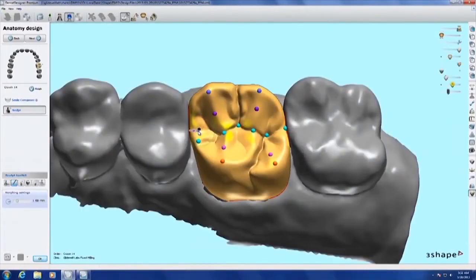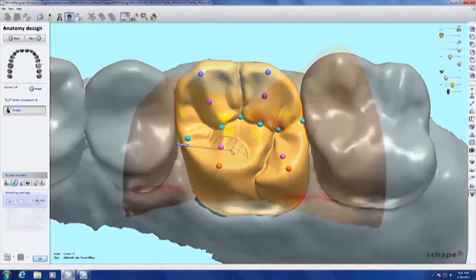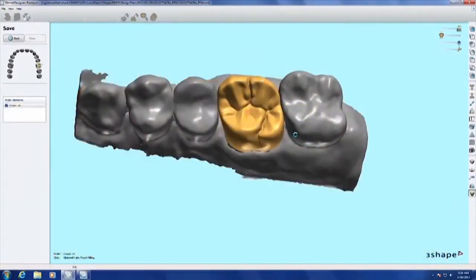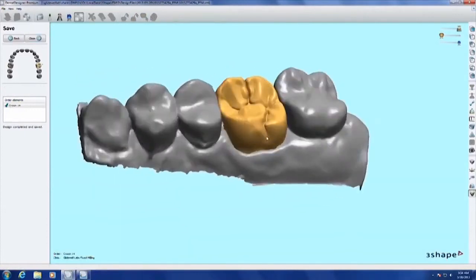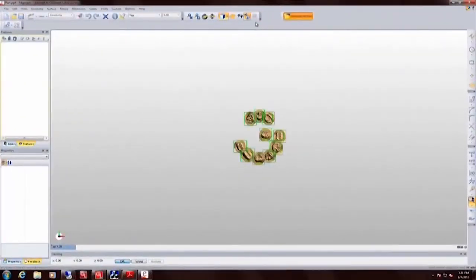As long as the dentist has left us enough room, which this dentist really did, you can see we've got an ideal anatomical pattern that it's going to propose for that particular crown. If there's not enough room, then it has to start making changes. We can make little changes here per the doctor's request if we need to on the contacts, but most of the time with us designing it the same way every time, most doctors don't have us make many changes.